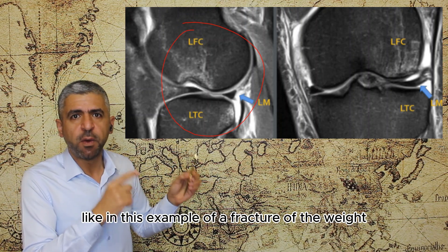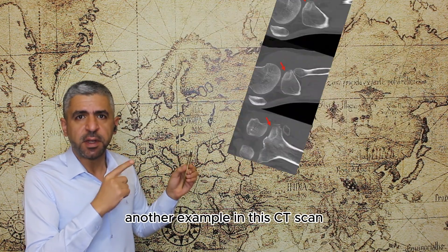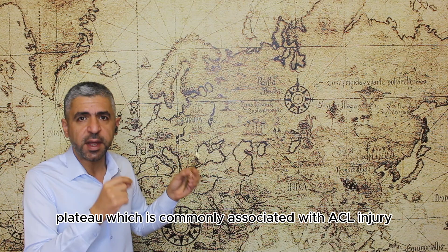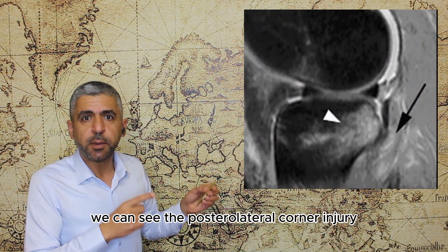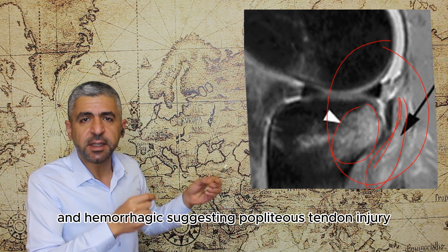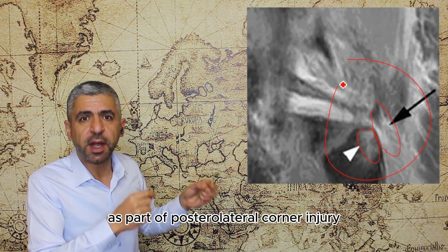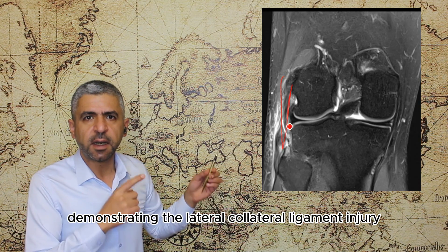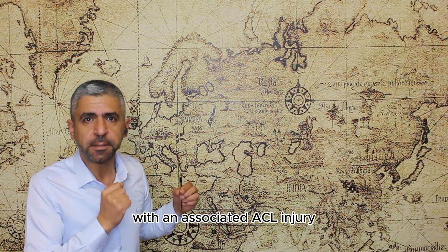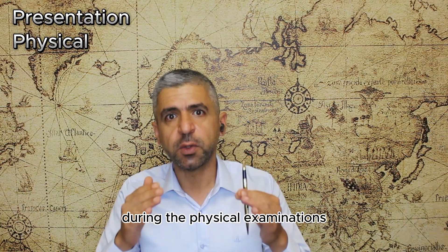This example shows a fracture of the weight-bearing surface of the lateral femoral condyle on sagittal and coronal MRI images. Another example on CT scan shows a fracture involving the posterolateral tibial plateau, commonly associated with ACL injury. On this MRI image, posterolateral corner injury is seen with the popliteus tendon swollen and hemorrhagic, suggesting popliteus tendon injury. Further examples demonstrate the arcuate ligament and lateral collateral ligament injuries as associated features of posterolateral corner injury.